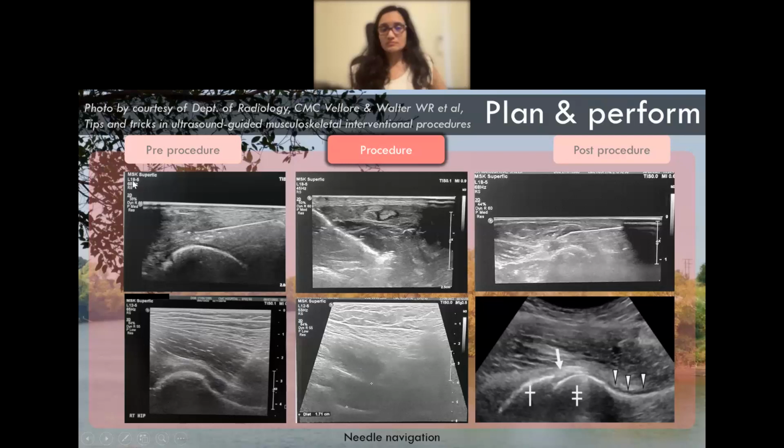In these images we can see we have used the very high resolution probe, that is the 18 megahertz, and when we use 12 megahertz, we can use this in heavy build patients, especially in hip joints where the depth will be approximately 4 centimeter. Sometimes it can be 6 centimeter, as in this case.